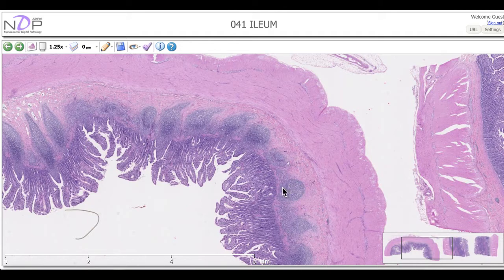We have the dense and unencapsulated lymphatic tissue, and you can see here these lymphocytes that spread and disseminated in this area just below the epithelium, the subepithelial region. We call it the diffuse lymphatic tissue and unencapsulated.